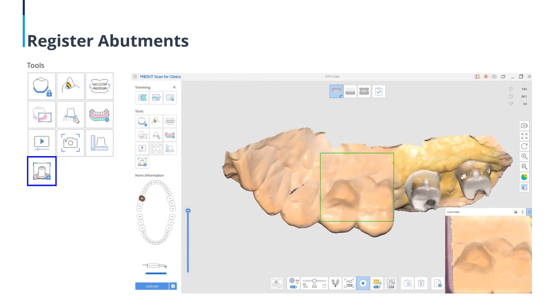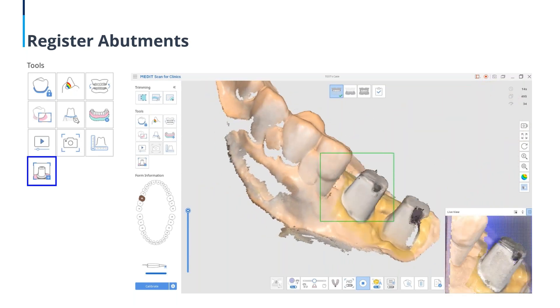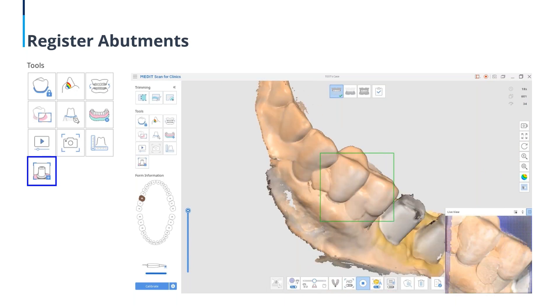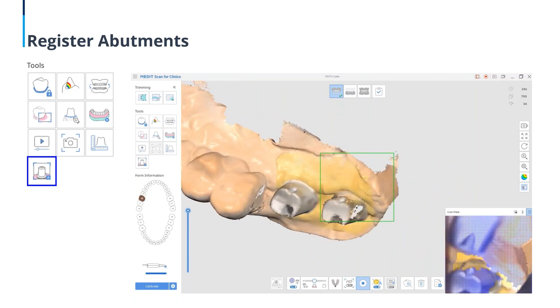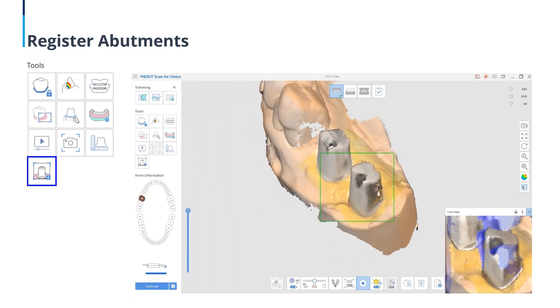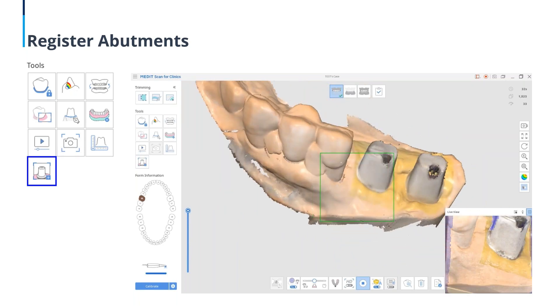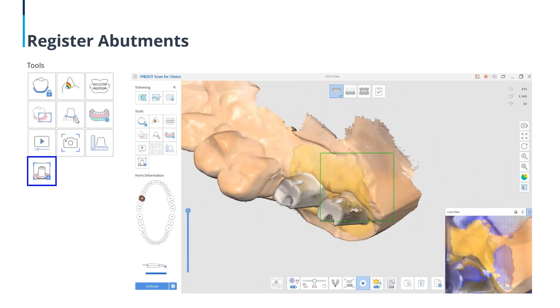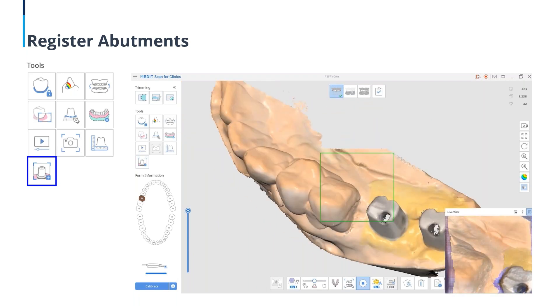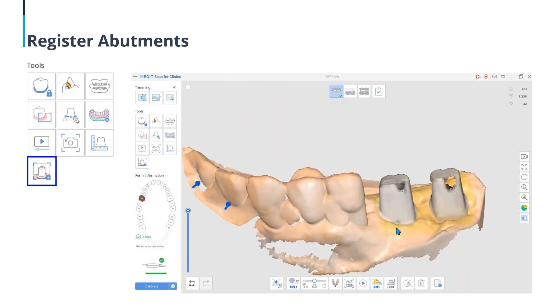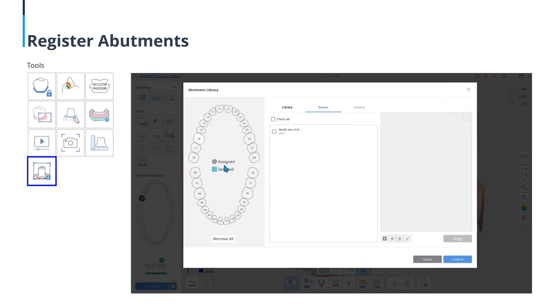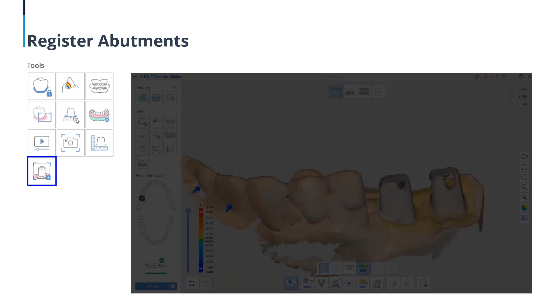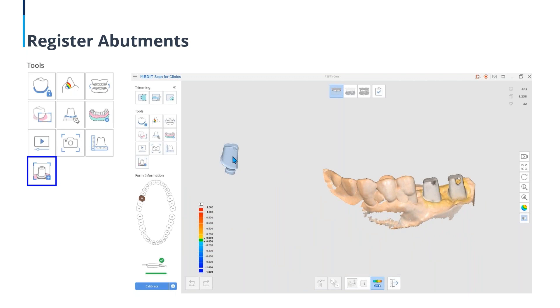What's going to happen now is we're going to scan the abutment in the patient's mouth. Obviously, this is being scanned on a stone model. I always like to give pointers of scanning while we're doing the webinars. If you've been scanning a lot, especially in the patient's mouth, you'll realize that it's a lot easier even than scanning on models. We want to get a really clean scan of this abutment right now. Let's go ahead and get the distal of that abutment. Once you've got a full complete scan, you can see the real time image there on the right hand side. This is simulating the scan of the patient's mouth. We'll go ahead and click on the abutment library, select the tooth, select the abutment. You can see there the name that we've named it. We're going to assign and confirm.